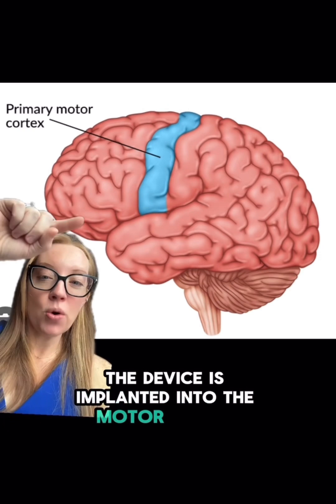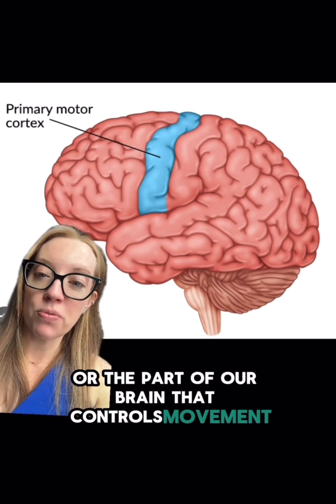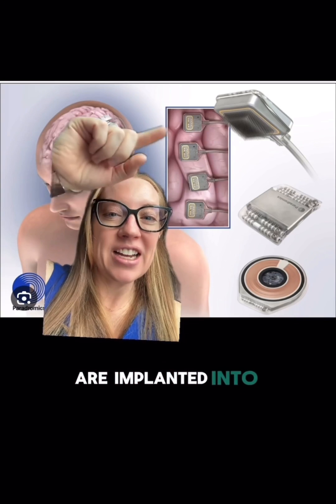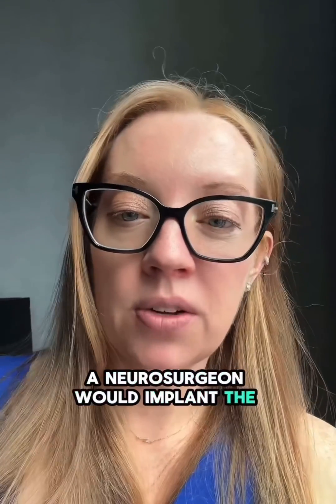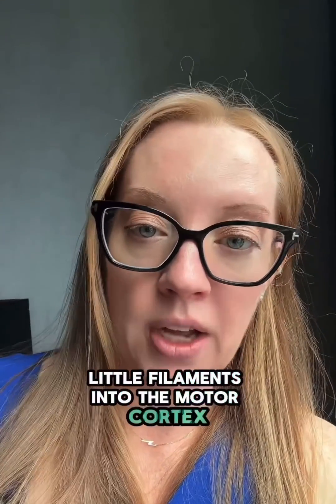The device is implanted into the motor cortex of the brain — the part of our brain that controls movement. Here's what the device looks like, and the small filaments are implanted into that motor cortex like this. You can see there are so many tiny little fibers implanted into the motor cortex. A neurosurgeon would implant the device, but a neurosurgical robot would actually implant those small filaments into the motor cortex.